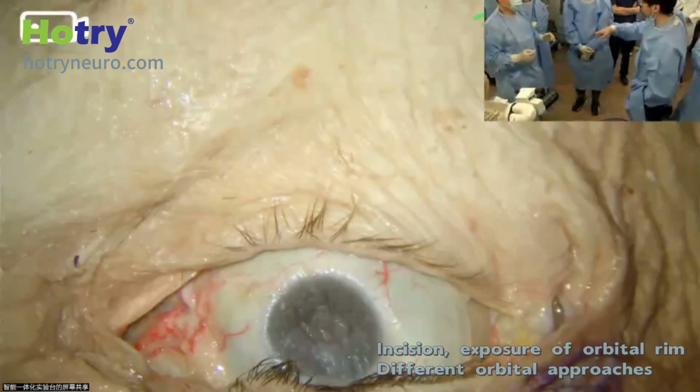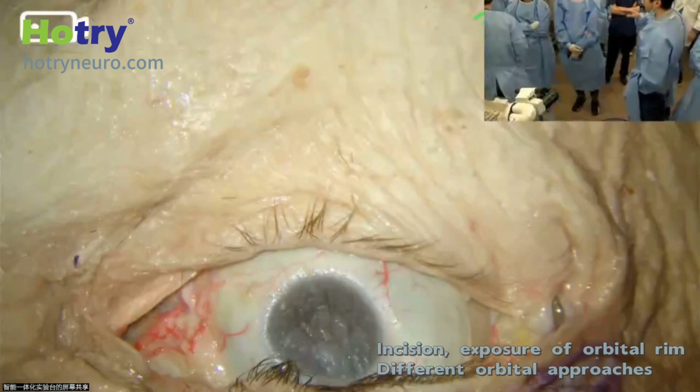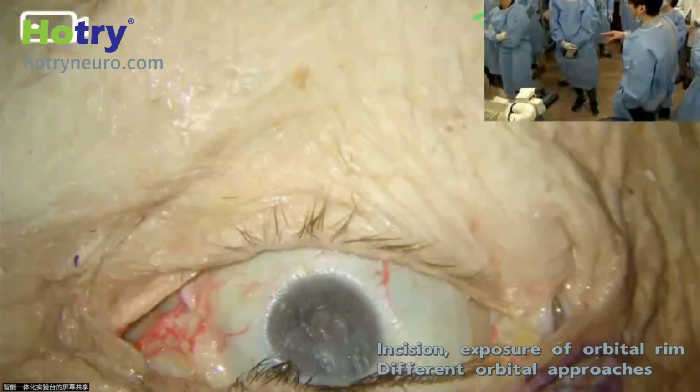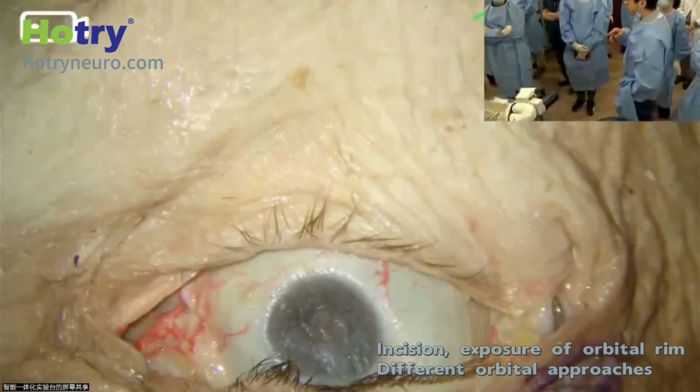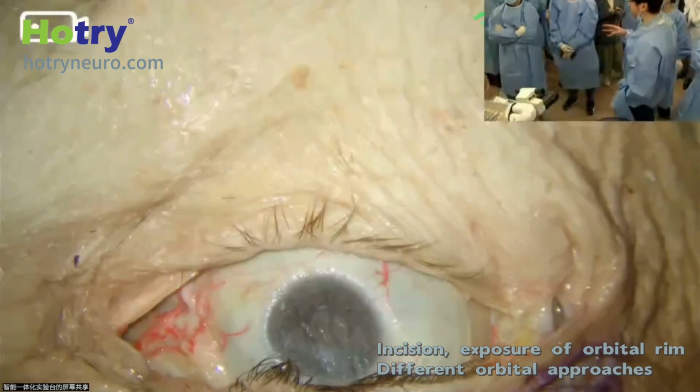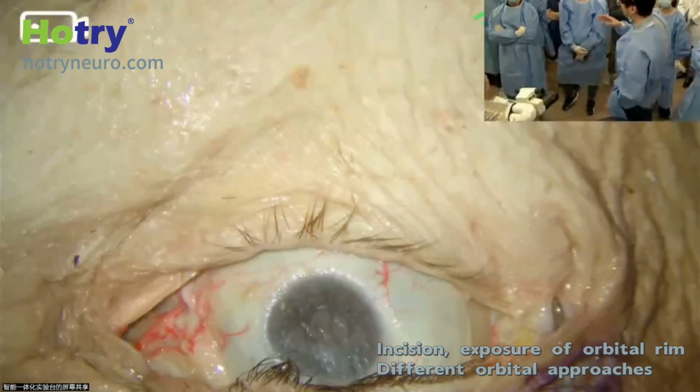Professor Yun will be around to guide you. If you have any problems or questions, he will show you how to do it. Then let's work on it for around an hour and see how far you go. But of course, the main dish will be afterwards, when we put in an endoscope.